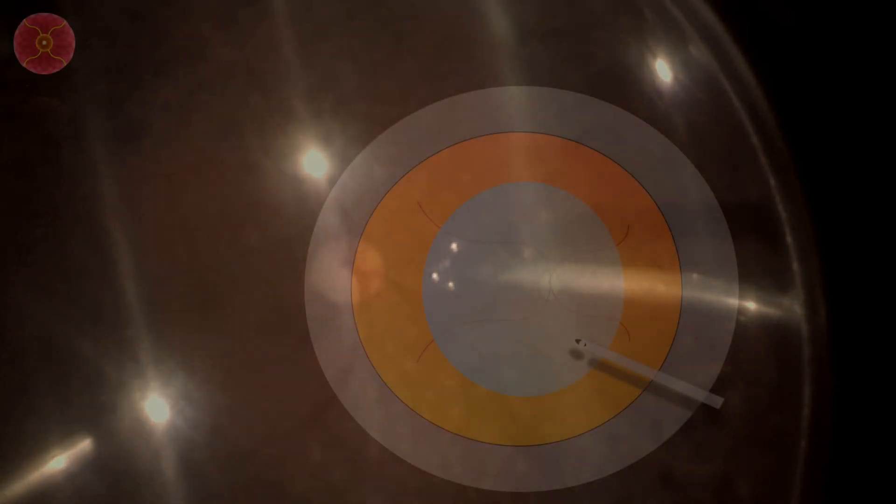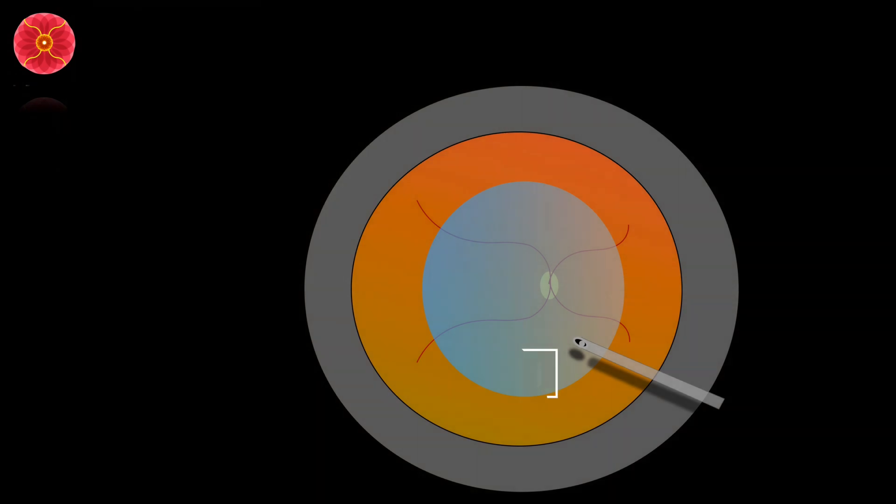During fluid-air exchange, you need to keep your instrument in the liquid interface. Note that as soon as you touch the liquid, the shadow acquires a letter eye shape with a dot above the instrument shadow.